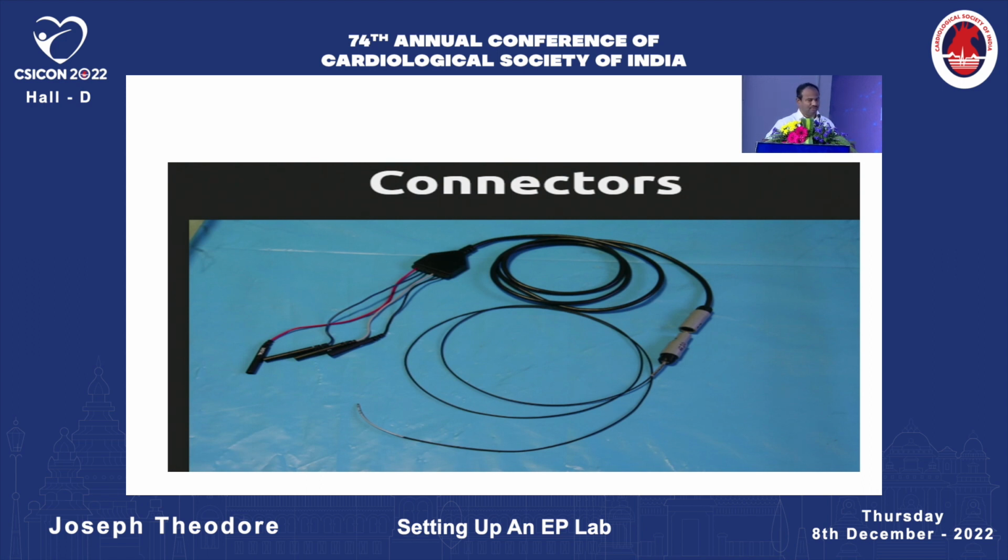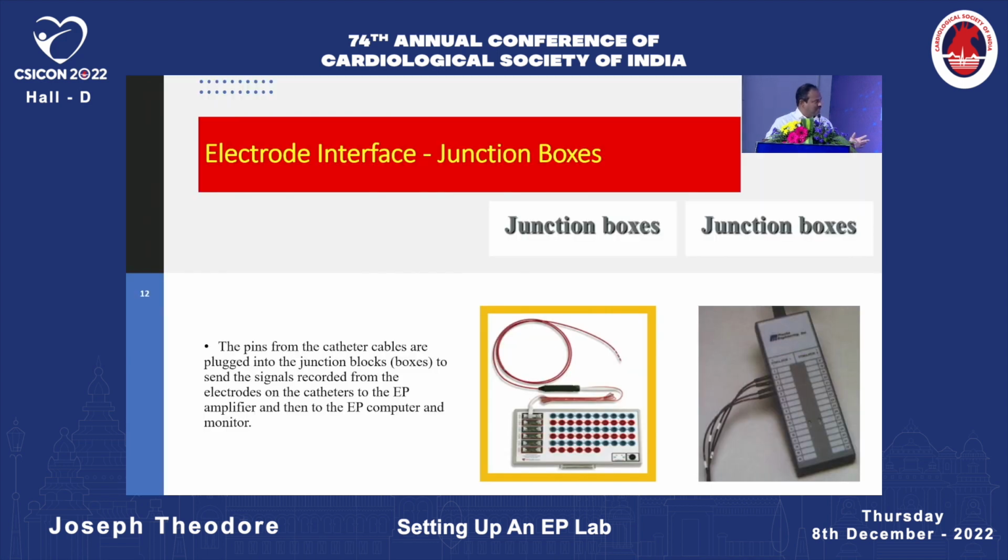The distal pin will stand for the 1. So from there, connect to the junction boxes. Junction boxes will send the signals to the amplifier, which will filter them out and then relay them to the computers, which can be used for displays.